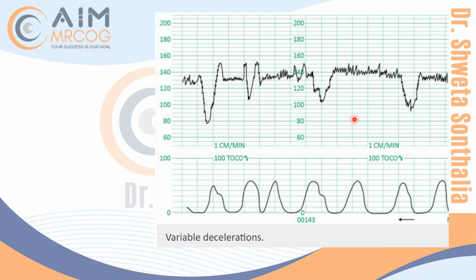So it raises an alarm in your mind that the deceleration will get deeper and deeper, because at the end, because of the cord around the neck, the baby is getting compromised. So I'm telling you, in your clinical practice, be very careful to label something as early deceleration which is changing in pattern. Early deceleration shouldn't change in pattern, first of all. It should be similar. It shouldn't become deeper and deeper and deeper.